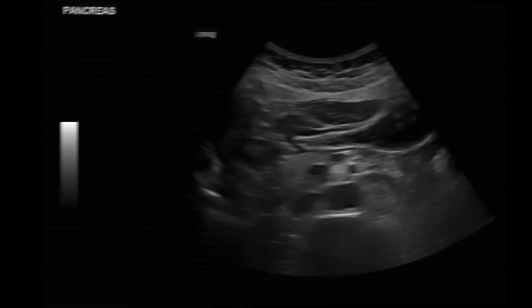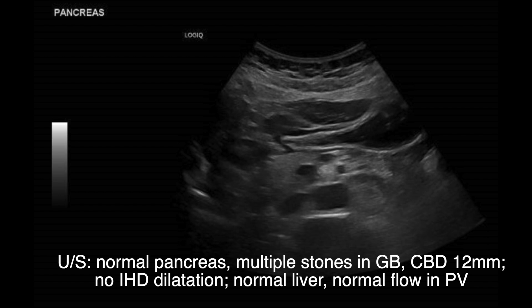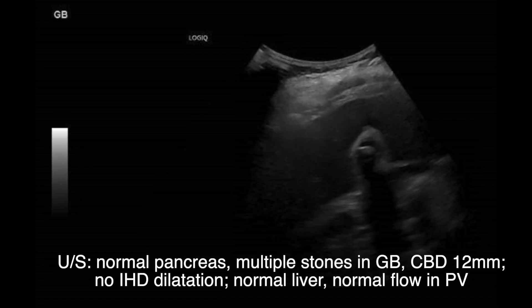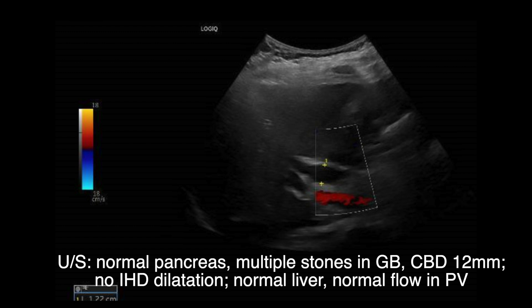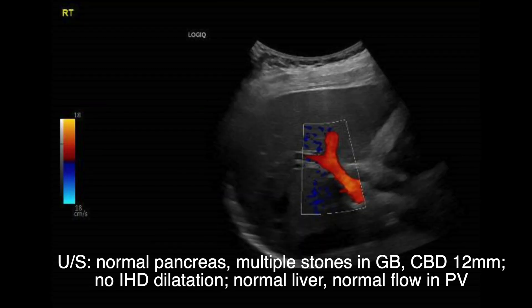Here is the ultrasound scan showing what was described as a normal pancreas, with stones in the gallbladder, a dilated common bile duct, undilated intrahepatic ducts and normal flow.